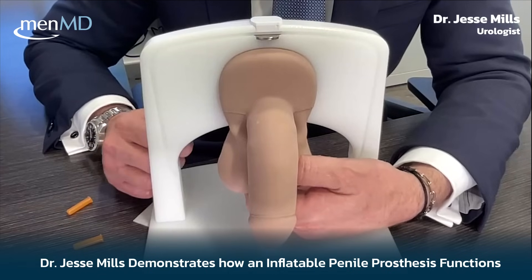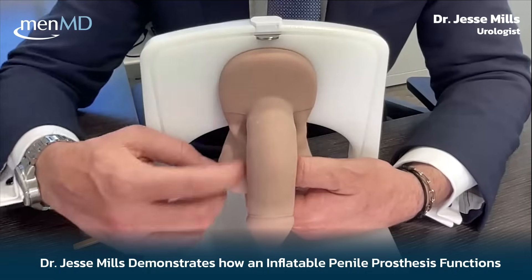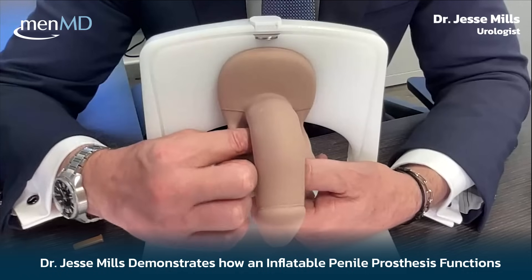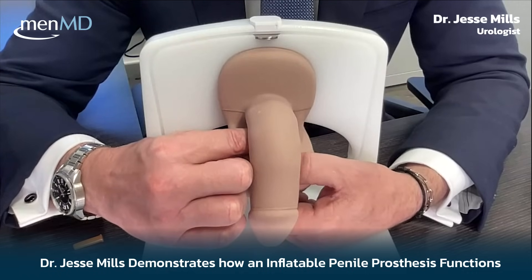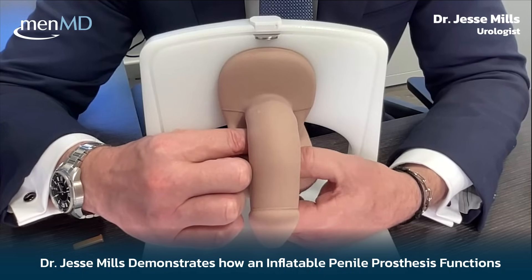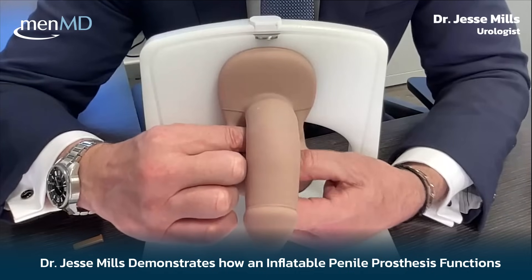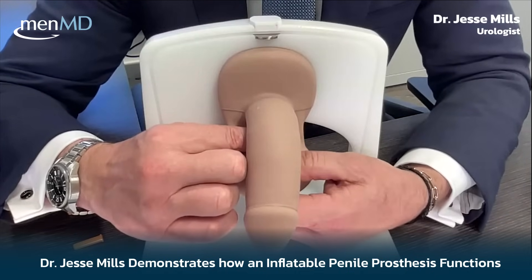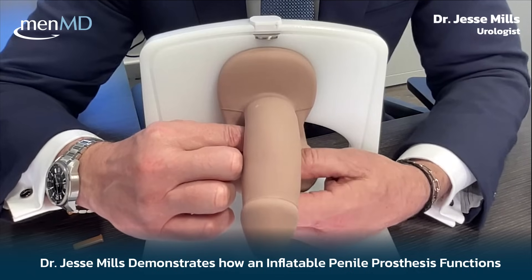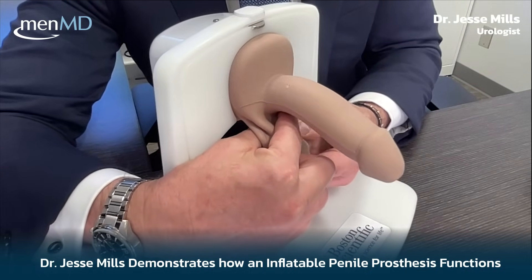Some men will be able to do this one-handed very quickly, but for the most part it takes a little time. Typically when I'm training guys, I'll have them stabilize the top of the pump with their non-dominant hand — I'm left-handed here — and that helps keep the pump from moving around in the scrotum. So it's anchored, you're holding up here, and then you just inflate. You'll feel a little give, and sometimes you can even hear it as that valve pops into the right place. We're starting to develop what looks like an erection suitable for penetration.